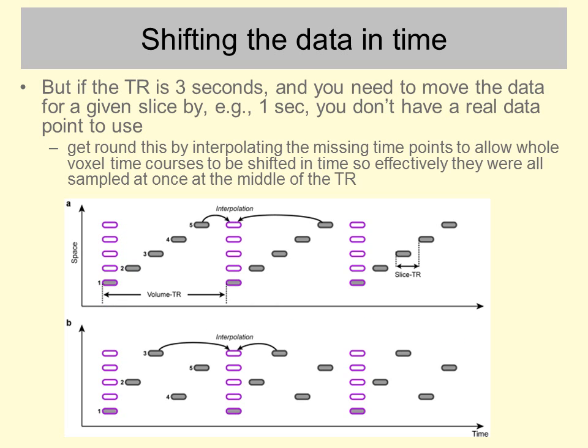So what this shows us is that for this set of slices, which the FSL general linear modelling stage assumes are all acquired at the same point in time, we see the actual time points of acquisition for slices 2, 3, 4 and 5 relative to time point 1 for a sequence in which the slices were acquired sequentially bottom to top, rather than the interleaved example I've been talking about so far. And the points in time where the pink shapes occur are actually the midpoints of the TR.